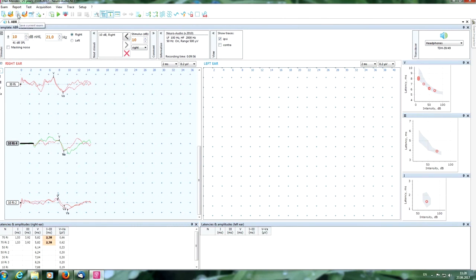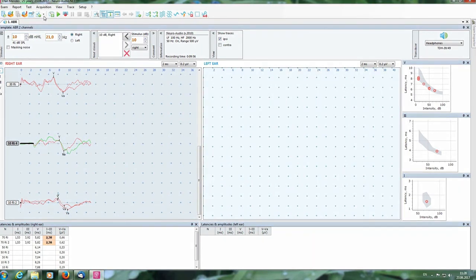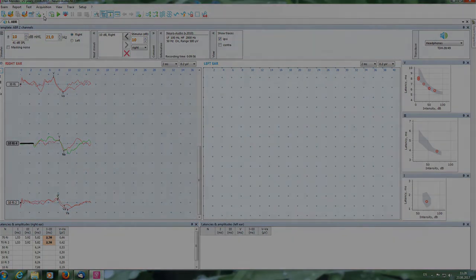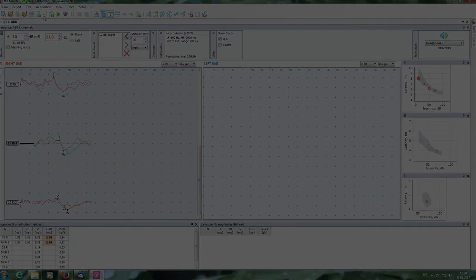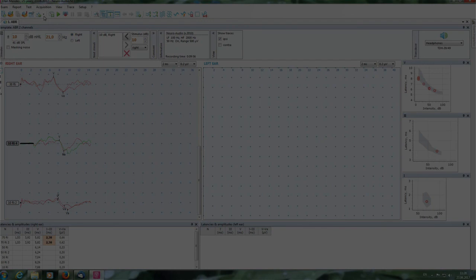Also you can repeat all the procedure on the left ear.